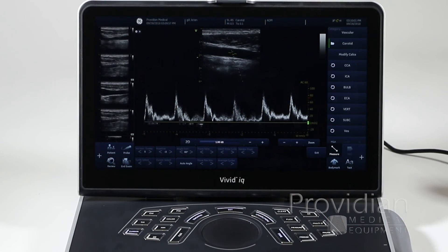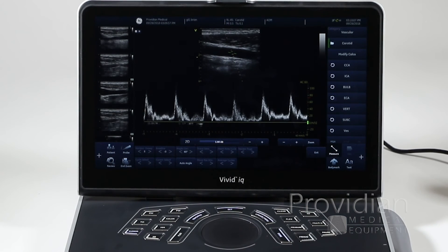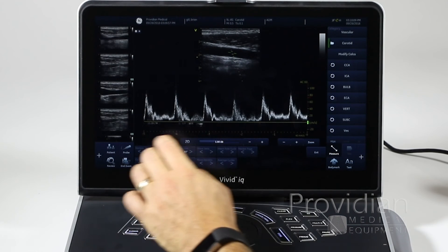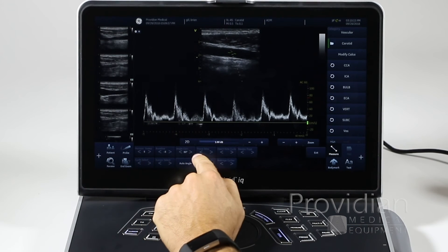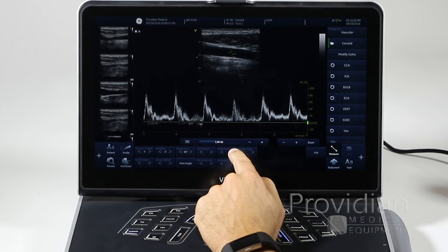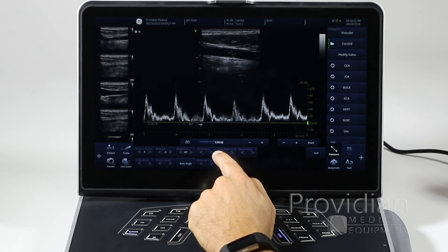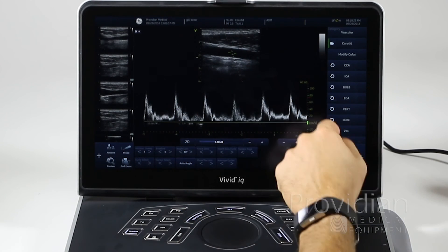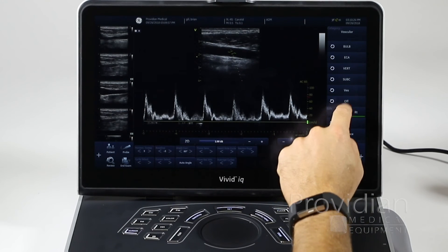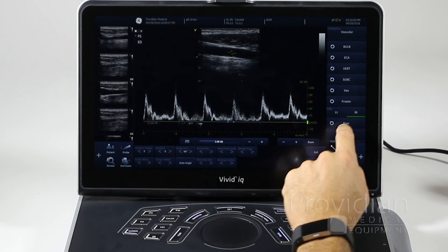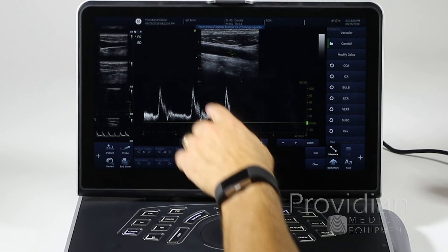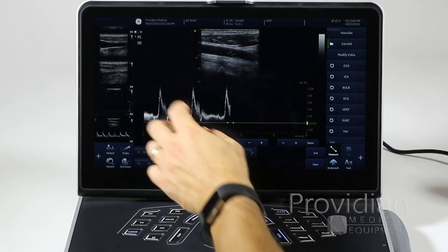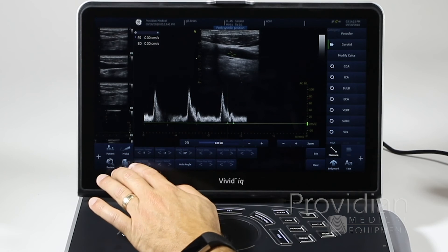Freeze jumped right to the measurements, which we went through over in the measurements section. But this is an interesting portion where you can change your horizontal sweep size, change your baseline, change the angle correction, trace sensitivity, and heart rate cycle — if you're attached to an ECG or you've got the auto calcs on. I could go through this heart rate cycle select and it'll pop up, and with the auto calc I can flip right through.